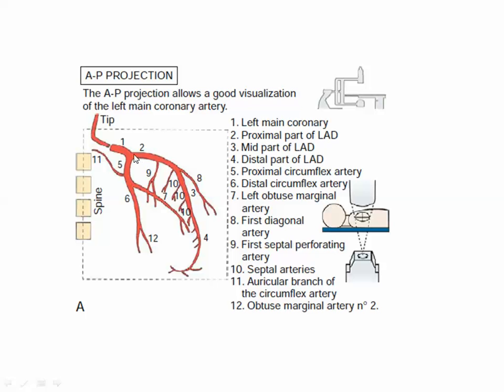So what will this be? This is the left main, this is the catheter, the tip of the catheter, and we'll see the shaft. Once it's AP, what will it cut? Left main or proximal LAD. So this is the left main. What is this vessel? This wall is the anterior, it's the LAD, and this is apex inferior, this is LCX, and this is the AV groove.